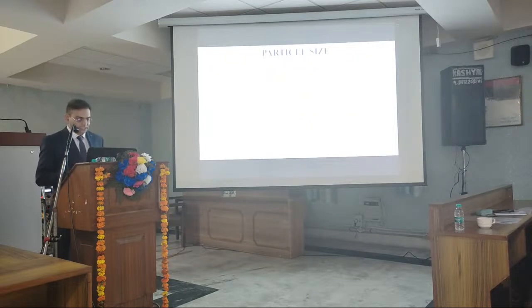The ideal size of radiocolloids for sentinel lymph node will be 100 to 200 nanometers. For this, we can pass the radiocolloid preparation through a millipore filter, which is a 0.22 micrometer filter, which will give a uniform particle size in the desired range. One important point to emphasize: the success rate of visualization of sentinel lymph node doesn't depend upon particle size, only the dynamics change.